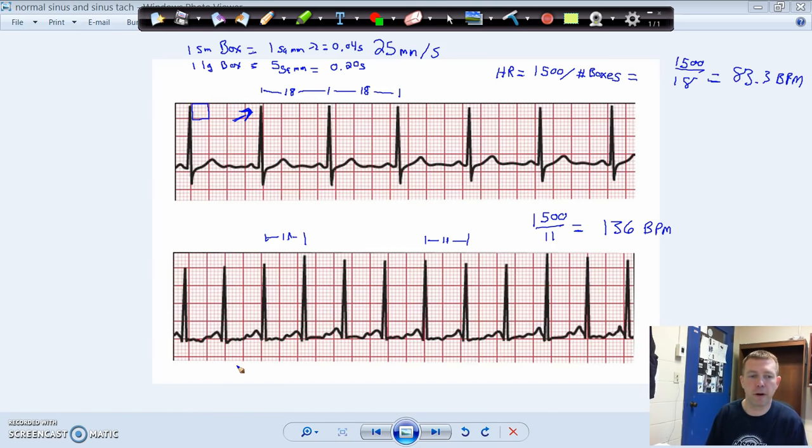So that's the easiest way to figure out heart rate. Count the number of boxes in between the same event on two adjacent cardiac cycles. Easiest one to use is the R wave. It makes this great peak for us to identify. Count the number of boxes in between, count the number of small boxes in between. 1,500 divided by the number of boxes is going to equal your heart rate.